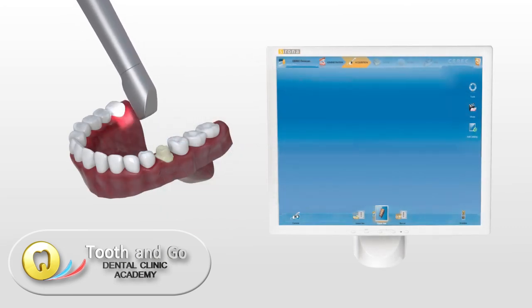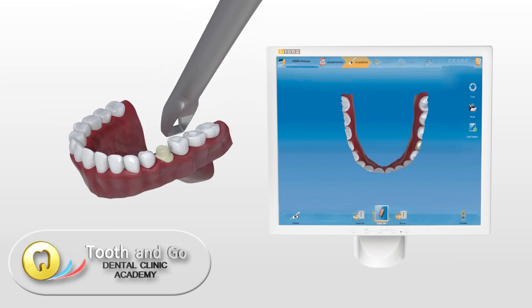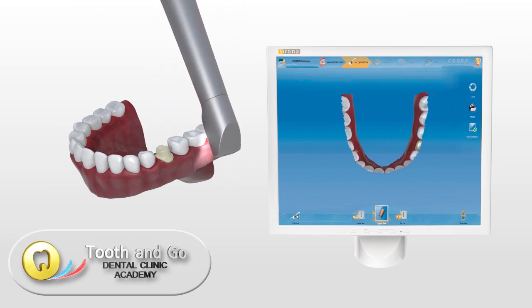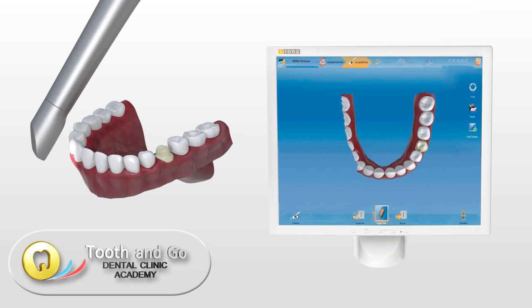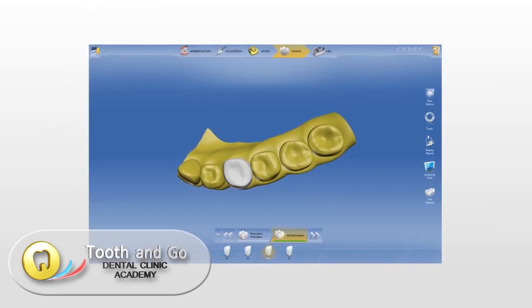The dentist scans the teeth with the CEREC acquisition unit and designs the crown with the CEREC software.